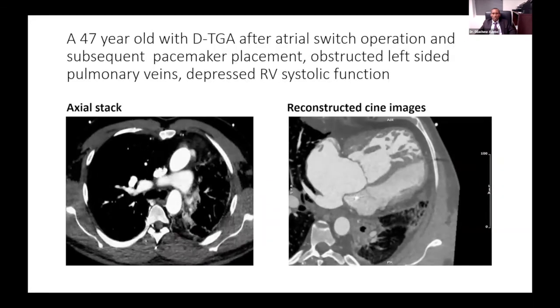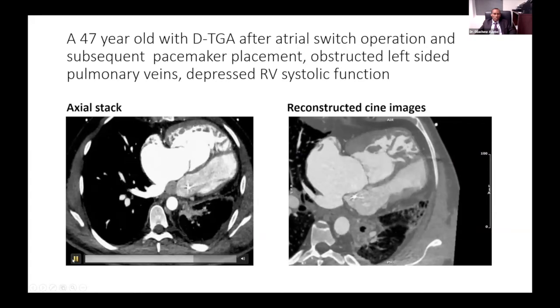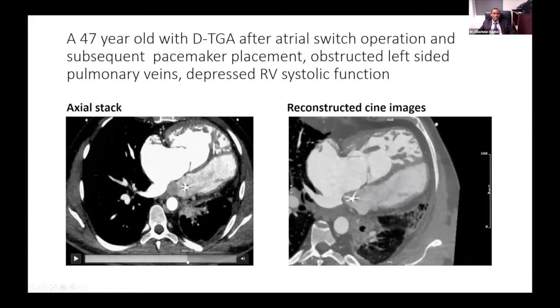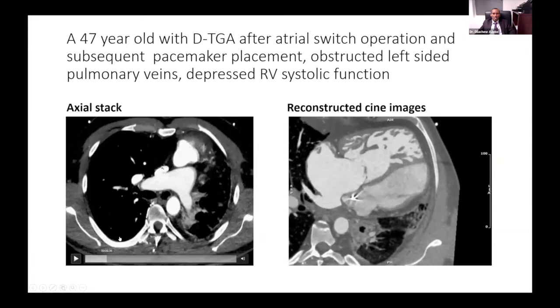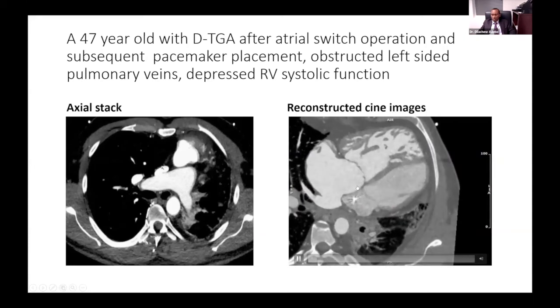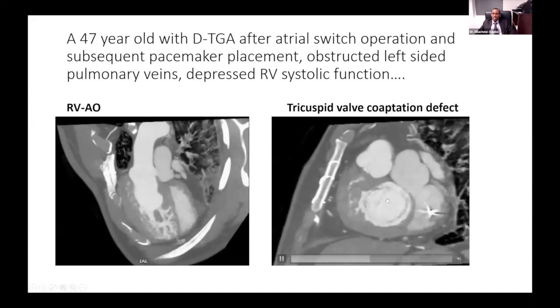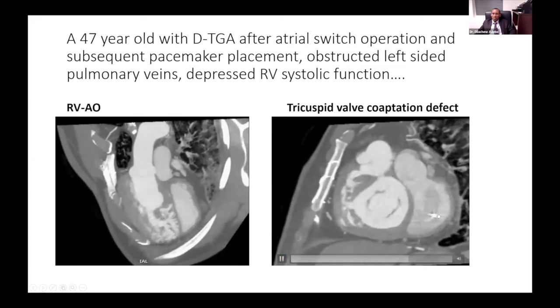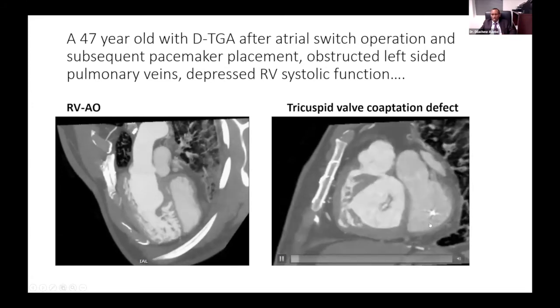This is a 47-year-old male with d-transposition. In those days there was no arterial switch, so the patient underwent atrial switch. You can see that this patient has patent right pulmonary veins, but the left pulmonary veins are completely gone — complete occlusion with hypoplasia and ground glass opacity on the left lung, with significantly depressed function. There is a pacemaker lead in the atrium, but it is not really affecting image quality. You can see the right ventricular-aorta on the CINE image, the tricuspid valve apparatus with high temporal resolution, and a coaptation defect in the center — even with a pacing lead artifact, it didn't affect contouring and function assessment with this functional cardiac CT.